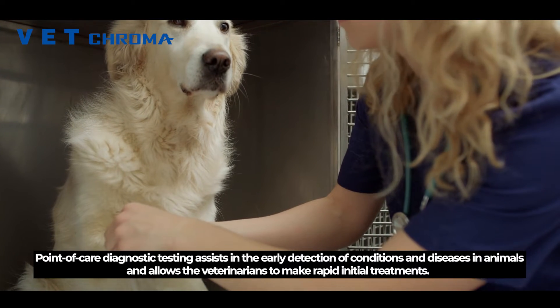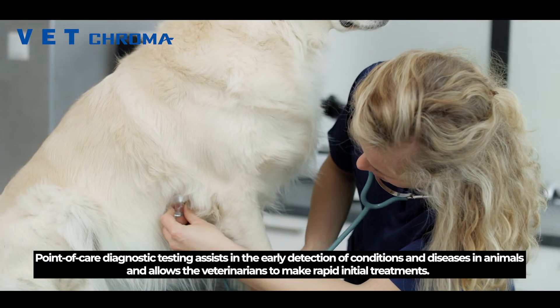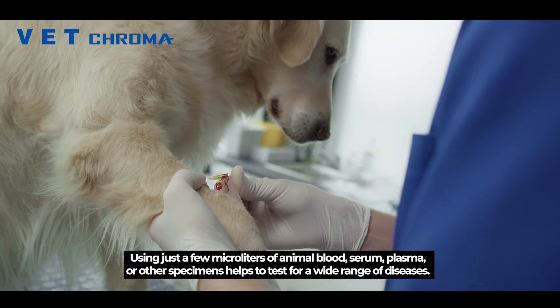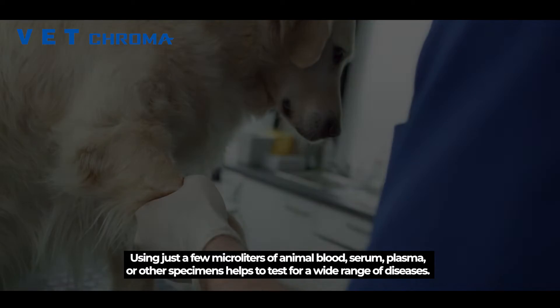Point-of-care diagnostic testing assists in the early detection of conditions and diseases in animals, and allows veterinarians to make rapid initial treatments using just a few microliters of animal blood, serum, plasma, or other specimens. It helps to test for a wide range of diseases.